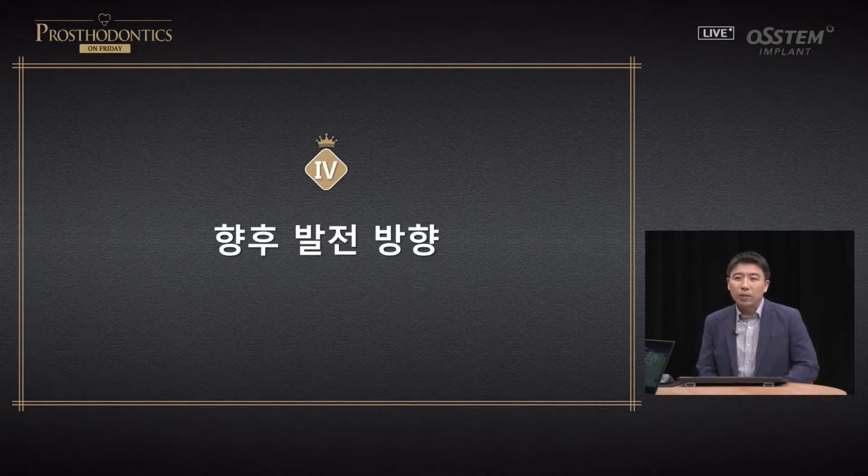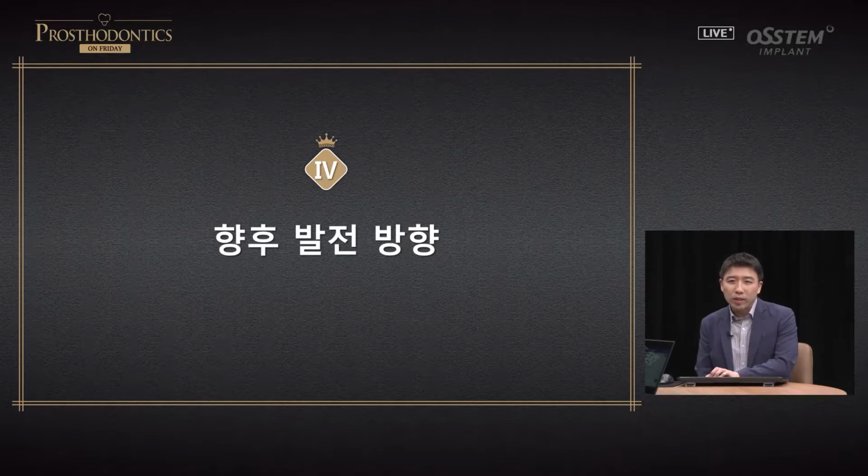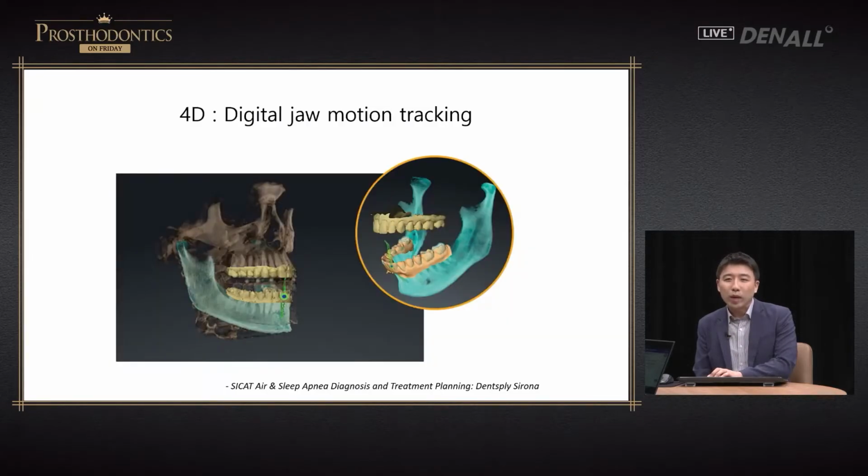This is the final part of the presentation. I'm going to talk about how future advancements are going to be made. I want to make some predictions. As mentioned earlier, 3D scan data, facial scan data, it doesn't include the dynamic factor. Therefore, you need to consider occlusion.